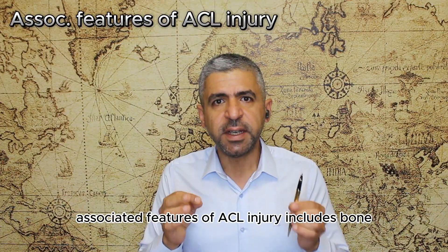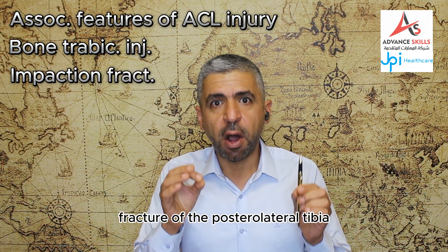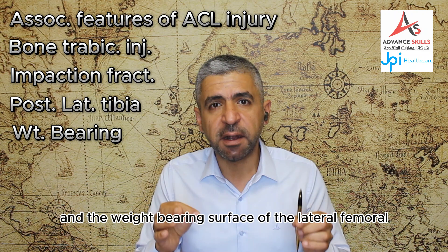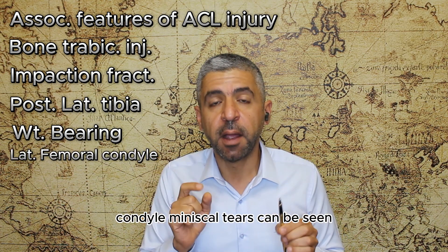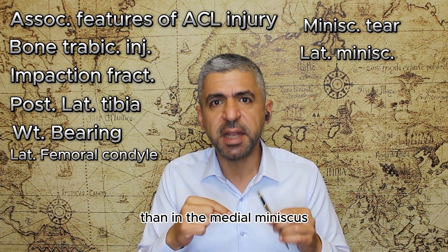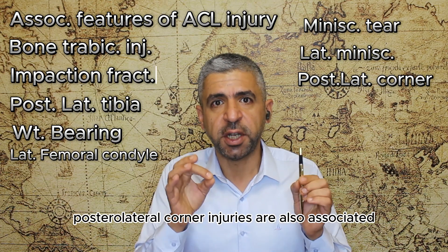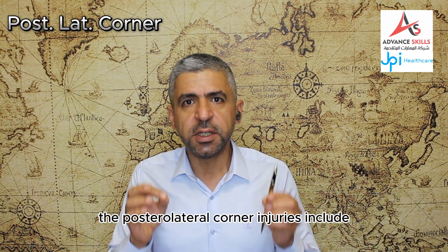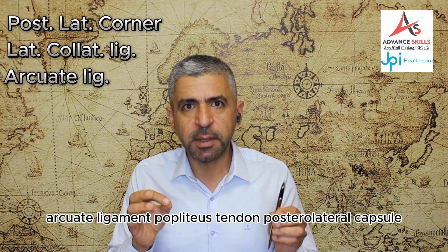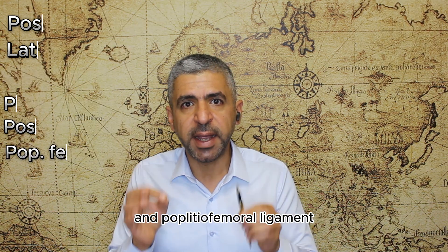Associated features of ACL injury include bone trabecular injury or impaction fracture of the posterolateral tibia and the weight-bearing surface of the lateral femoral condyle. Meniscal tears can be seen, more commonly in the lateral meniscus than the medial meniscus. Posterolateral corner injuries are also associated features, including the lateral collateral ligament, arcuate ligament, popliteus tendon, posterolateral capsule, and popliteofemoral ligament.